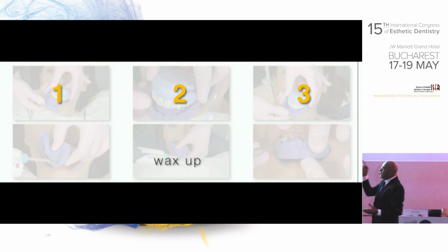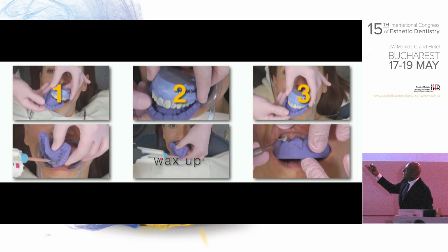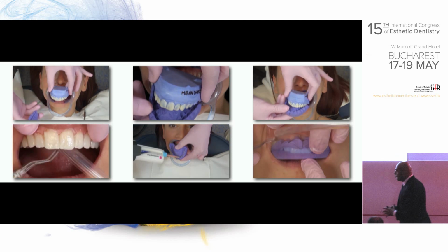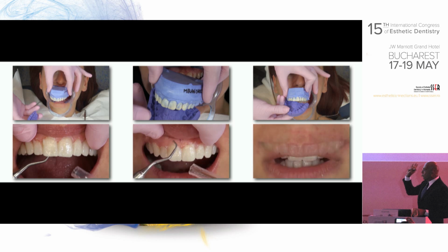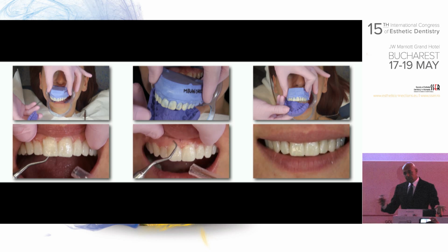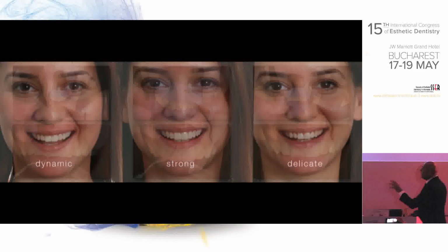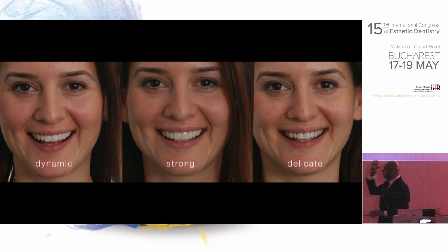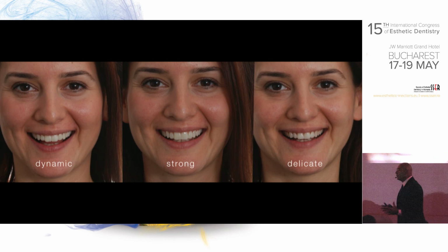So we said, what if we do it in a different way so that we'll find out what the patients like? Even in that case, I did a very, very accepted mock-up. We sat with Adriano and said, for some cases, for the startup, let's do 3 different wax-ups. And look at these. All 3 of them are beautiful. I mean, if I were the patient having one of them in my mouth from the beginning, I would say, wow, this is unbelievable.